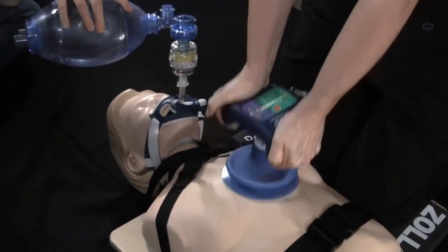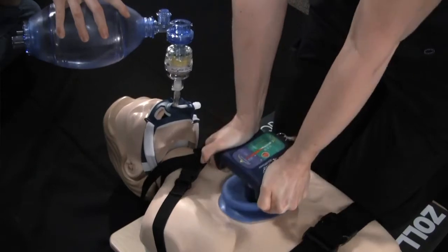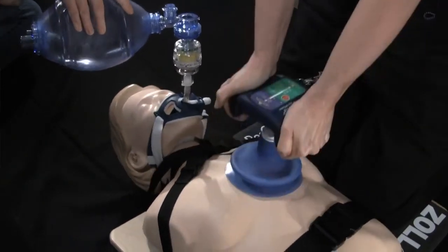The rescue pump is a handheld suction cup device that actively lifts the chest to help further enhance the vacuum in the chest.